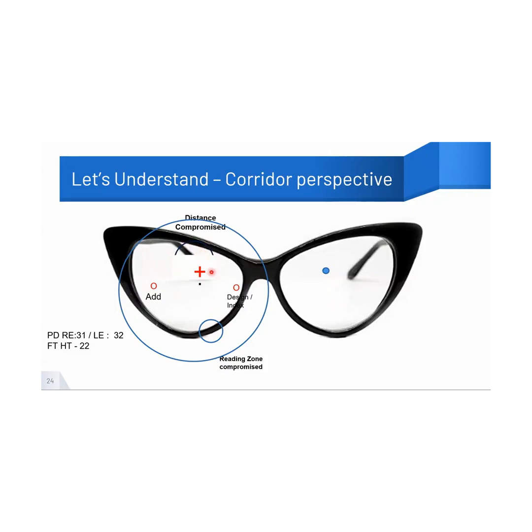Imagine if this customer is going to be a myopic, then definitely they are going to not feel good, because they will need a distance which is equally important. If they are low myopia, it's fine. If they are low hyperopia, it is fine. Okay, so if they have low minus power, or low plus power, it is still okay. But where the challenge would come is it's a long corridor and the reading zone gets cut. So in regular corridor, this could be a challenge.